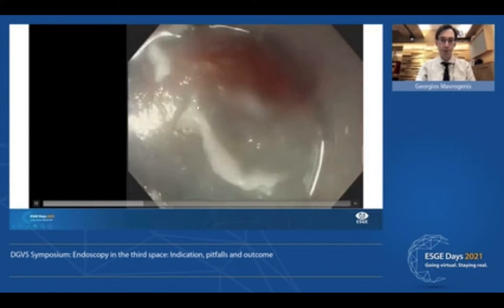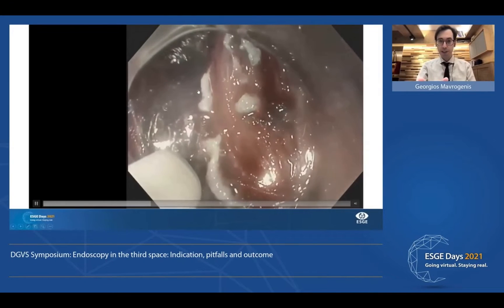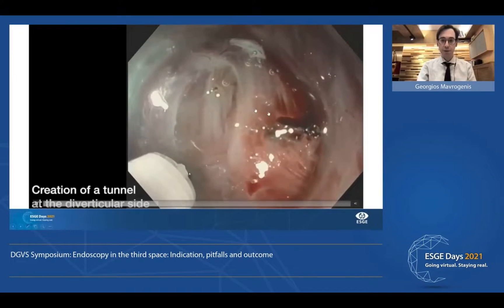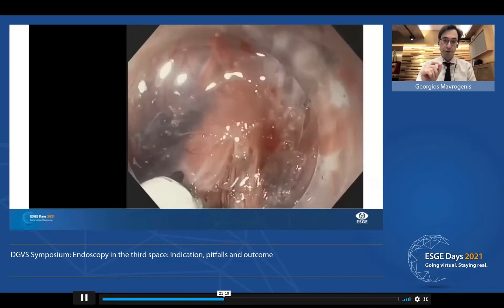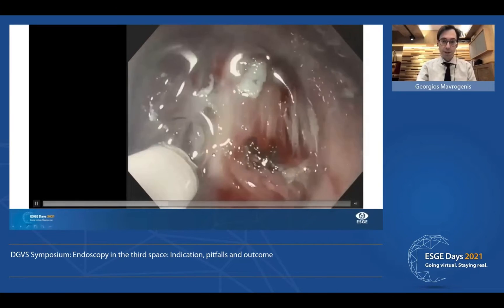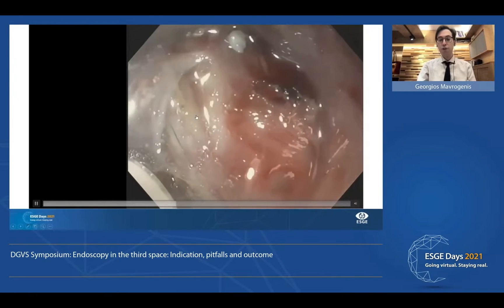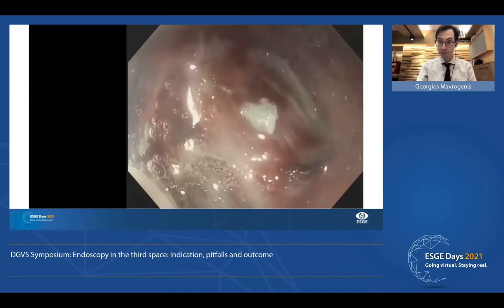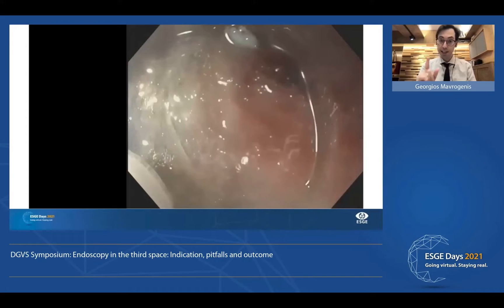You'll see the septum here. Now we have to create the first tunnel on the left side, which is the diverticular side, and then create a second tunnel from the other side. A very crucial step is to dissect very close to the muscle. Similar to POEM, we're trying to work close to the muscle — we may damage the muscle rather than the mucosa, which has to stay intact.